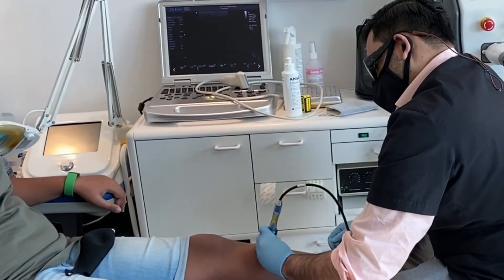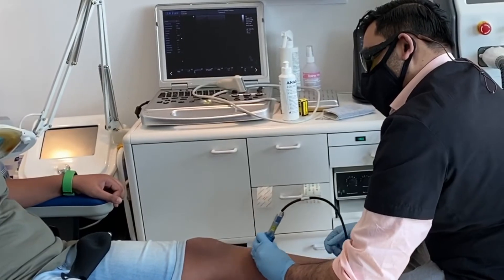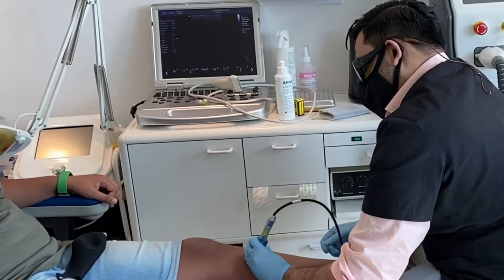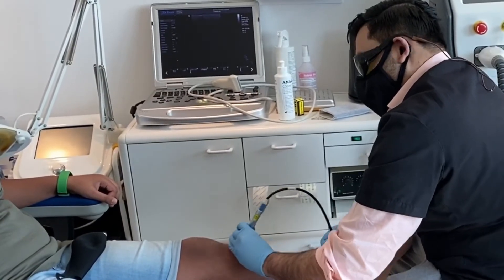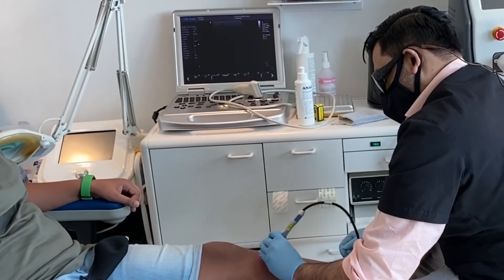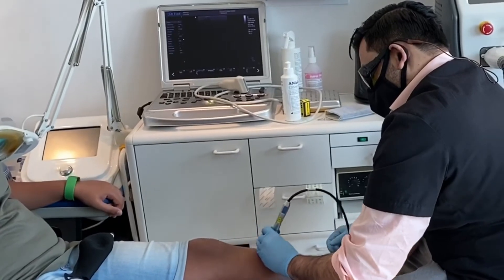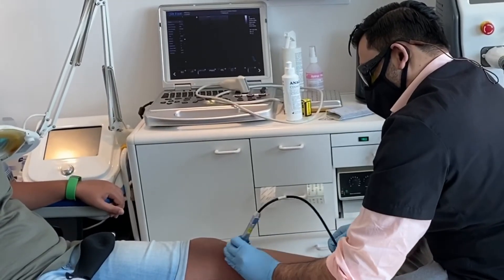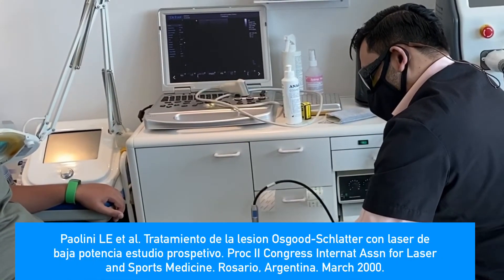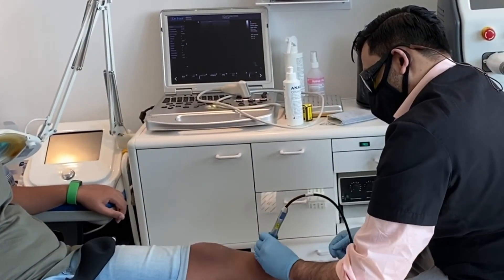How does that feel? There's been some good evidence regarding the use of class 4 laser for Osgood-Schlatter's by Poloni, who used this for quite a few patients and had really good results.